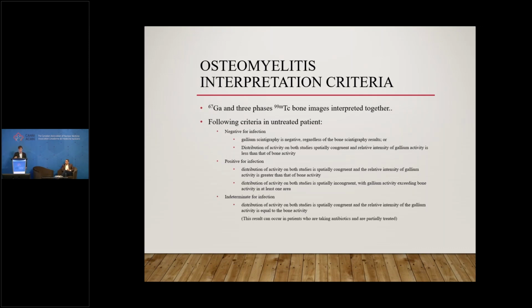And unfortunately, a lot of patients who have a bone and gallium scan are currently being treated with antibiotics, and we're faced with patients who have partially treated osteomyelitis. And so we have a third category: the distribution of activity of both studies is spatially congruent and of equal intensity.